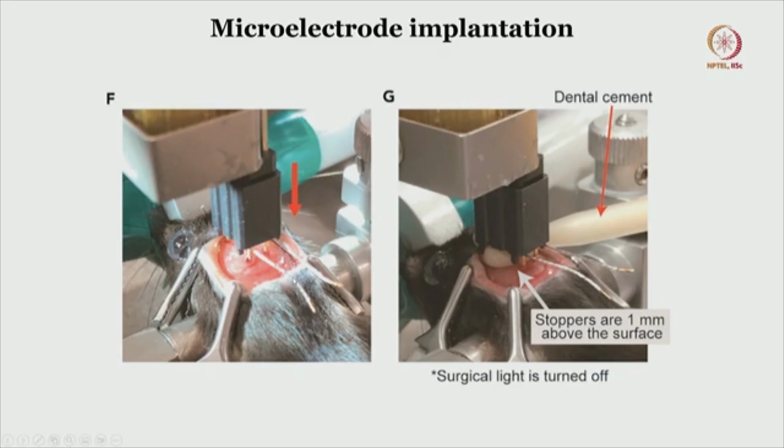These electrodes which are protruding outside are basically for the recording of EMG, not ECG. ECG is electrocardiogram, EMG is electromyographic signals from the muscles of the neck. That is the reason they have a long extension of the electrode which is going to be inserted into the neck muscles, you understand. That will help us identify the muscular activity during a seizure, or any seizure-inducing activity, or any cortical stimulation if you want to perform.